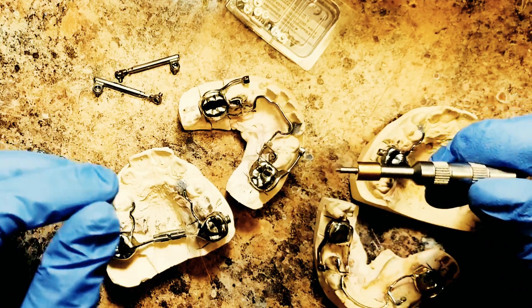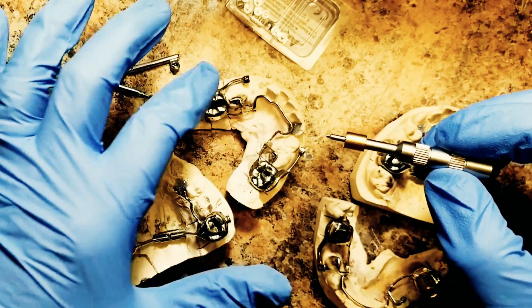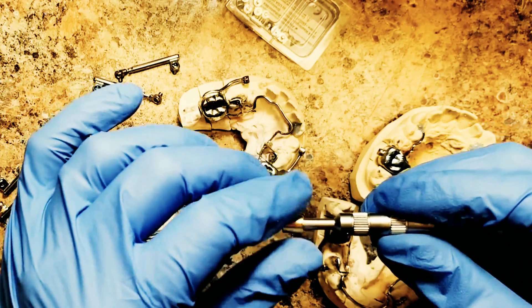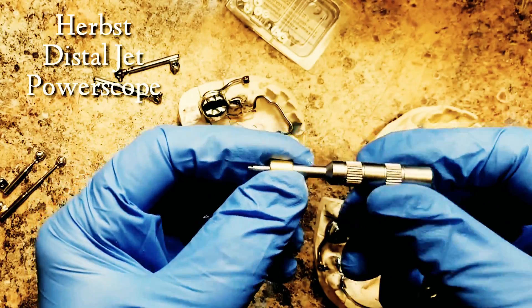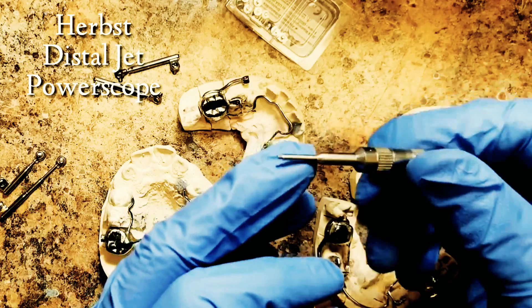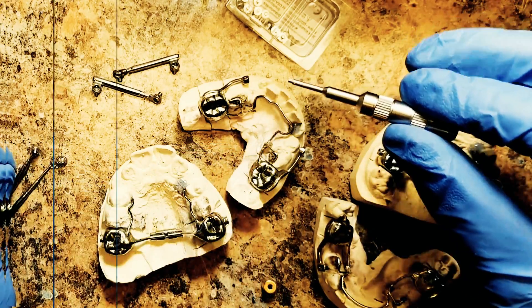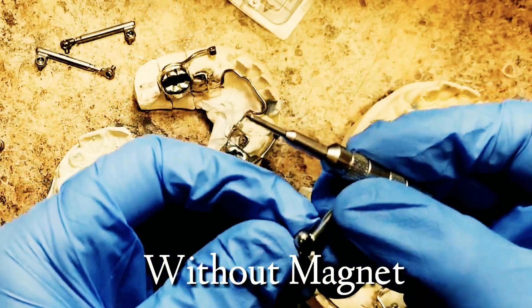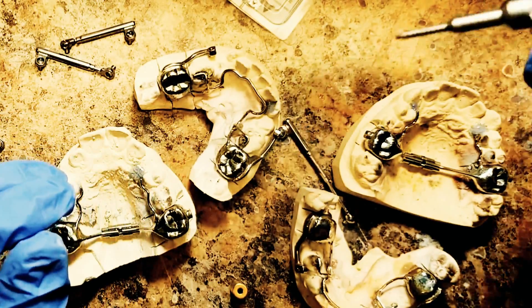Hey everybody, this is to showcase a product by American Orthodontics that's going to aid in putting the arms on a Herbst appliance — or you can also use this for the Power Scope. It's a little magnet that goes on to your screwdriver, so instead of using an Allen wrench, you use this fancy screwdriver, which really makes it easy to assemble the Herbst component. It fits into a little hex head screw.